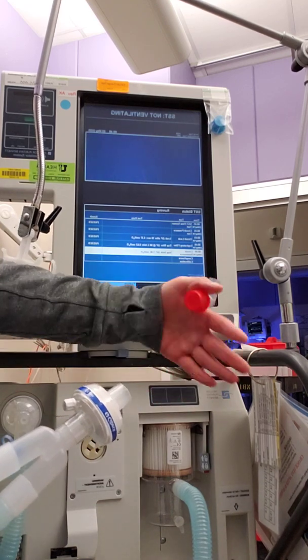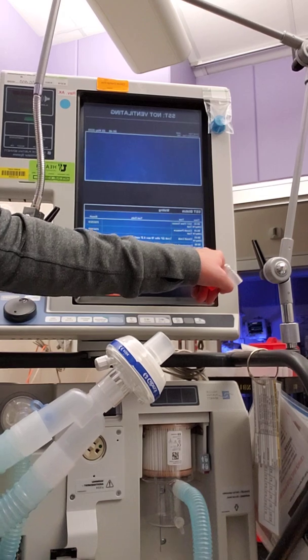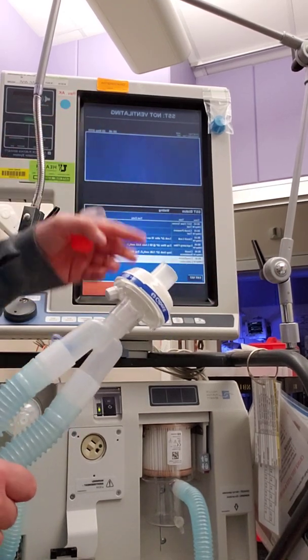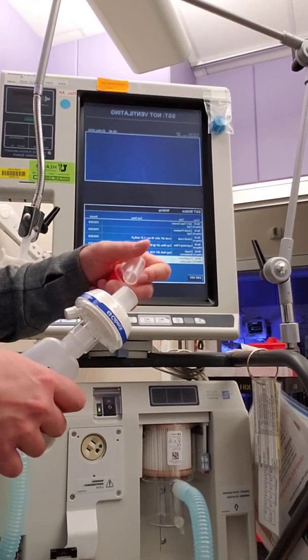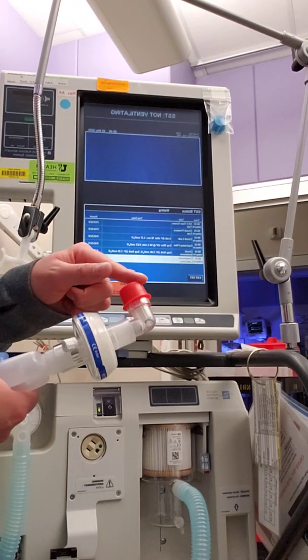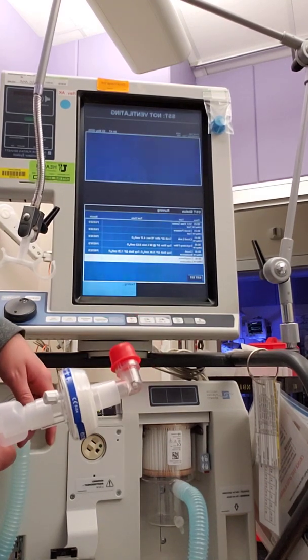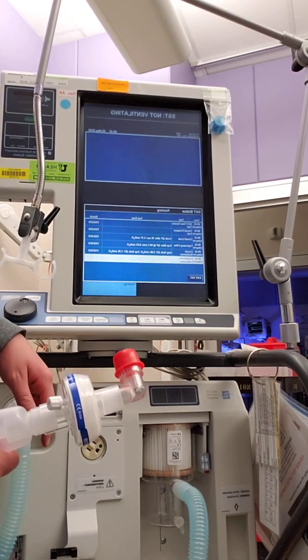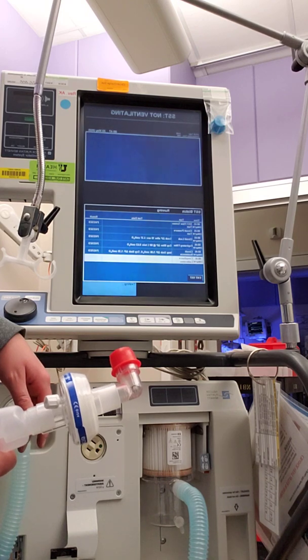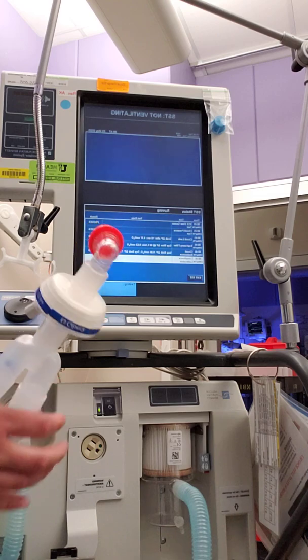And there's flow coming out of here. Okay, we passed. Okay, the last thing, we're checking compliance calibration, making sure that we are at a stable place for our compliance on our patient. We're going to block the Y again, so plug the port and press accept. Takes a minute, has to think about it.